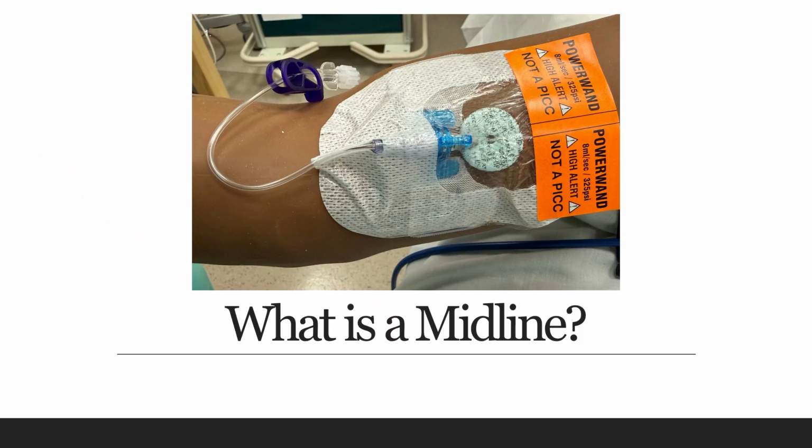So now we're getting more in the territory of the purpose of this lecture. Not too much information on this slide, just to give you an idea of what a midline catheter looks like when you dress it. So let's get into the nitty gritty of what's going on with the midline, what the differences are, and why you might want to do this instead of a PICC or a central line.